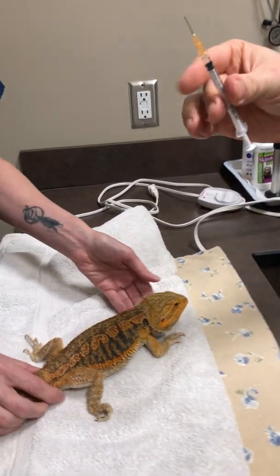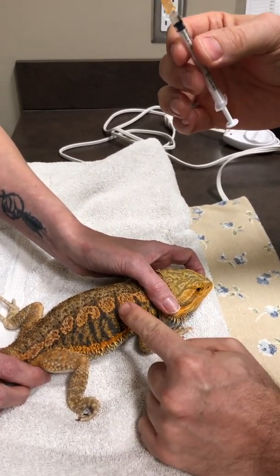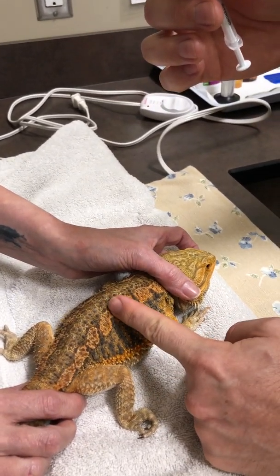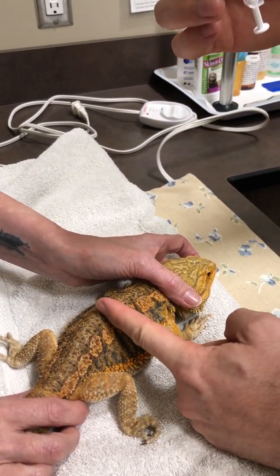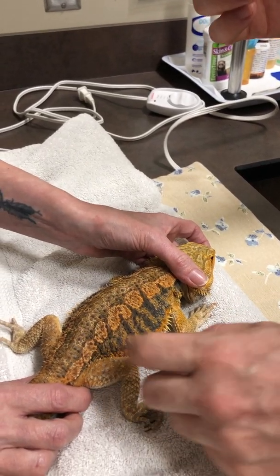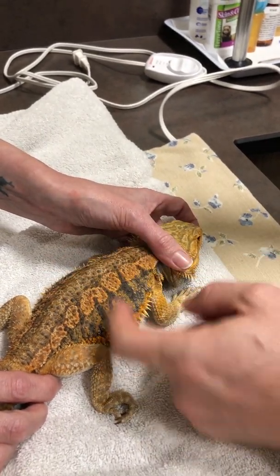When we're giving this injection, it can go under the skin or into the muscle. Regardless of which method you're using, we want to be in the front half of the bearded dragon. You don't want to go in the back half, back legs, or anything like that — always stay above the waistband area upwards.